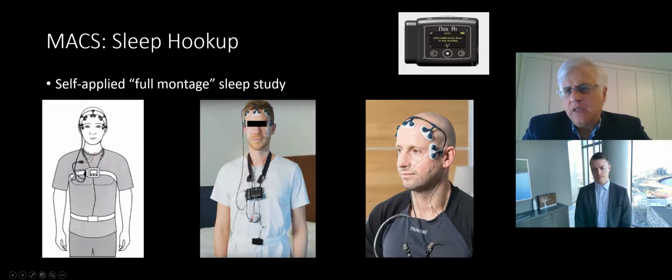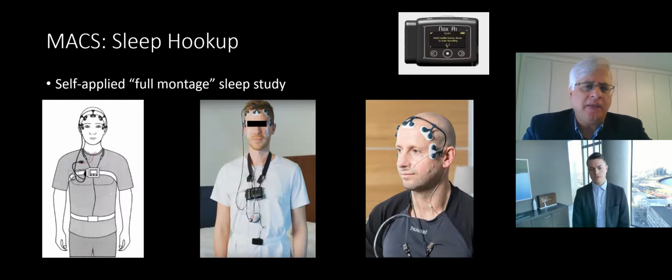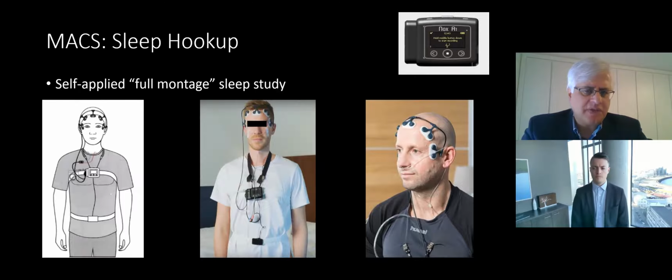Aside from this lead, everything else that you are familiar with from the standpoint of polysomnography, whether it's the use of nasal cannula, as you see in this individual, or the use of electrocardiography, or even monitoring leg movements, are available and can be done with the configuration that you see in this individual in the middle. So the basic premise is pretty straightforward.